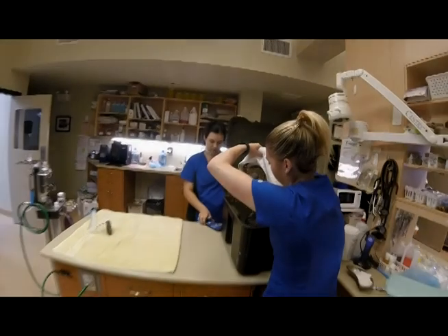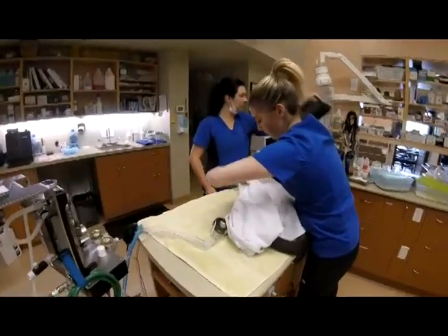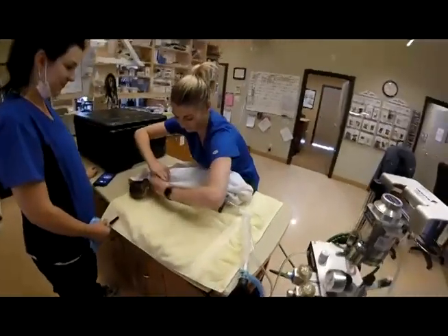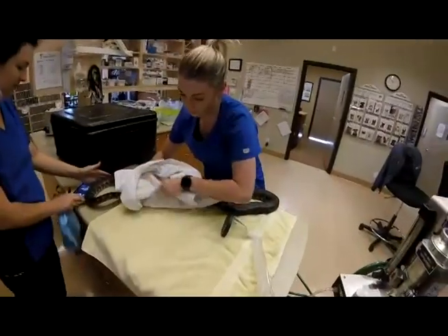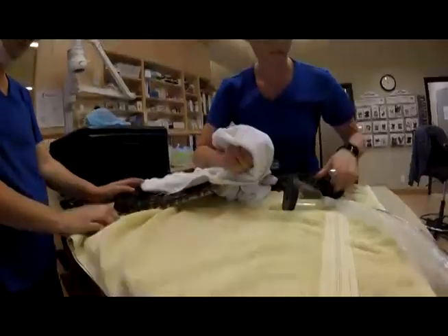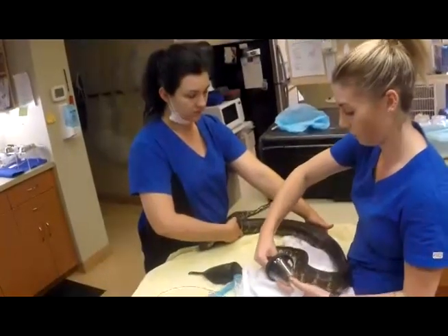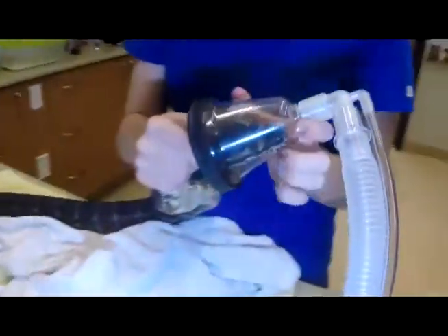She was presented to us because of the inability to actually pass her eggs. She'd been monitored for approximately 2 weeks now that she was overdue. The owner, a very experienced snake breeder, was able to determine that it seemed as though something was actually causing her to physically be unable to lay the eggs. With the right environmental conditions where other snakes would certainly have laid, she seemed to have the inability to do so. Placing her under general anesthesia is done by placing a mask and using isoflurane in order to be able to bring her to a surgical plane.